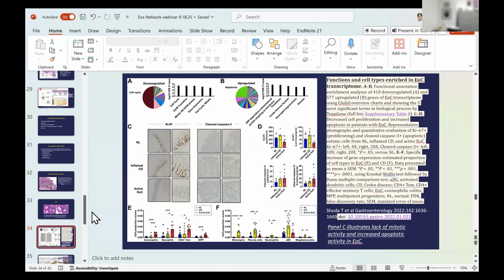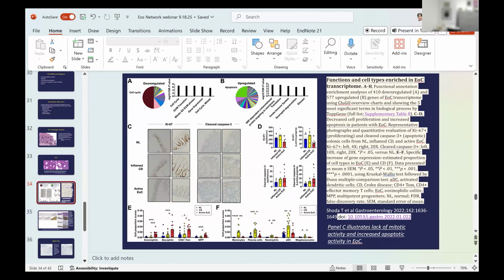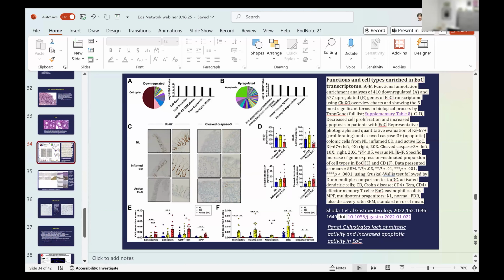And it's a very busy slide, but on the left-hand side, there are brown cells in panel C. There are brown cells, brown staining cells. They're all in varying stages of the cell cycle, not resting. So they're either on their way to or from mitosis. And the top one is normal. There is a lot of mitotic activity normally in the GI tract.